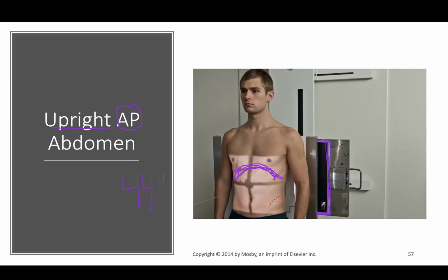You will notice that this is the incorrect marker. The book did that. It said right or R, but this will be the patient's right side. This side will end up here on the patient's left side. So this should have been a left marker, but that's a good spot to put it, and it'll end up right there on the x-ray itself, if you have it there on the IR.